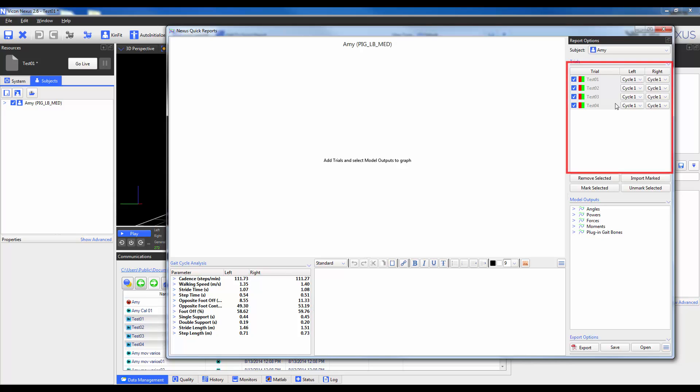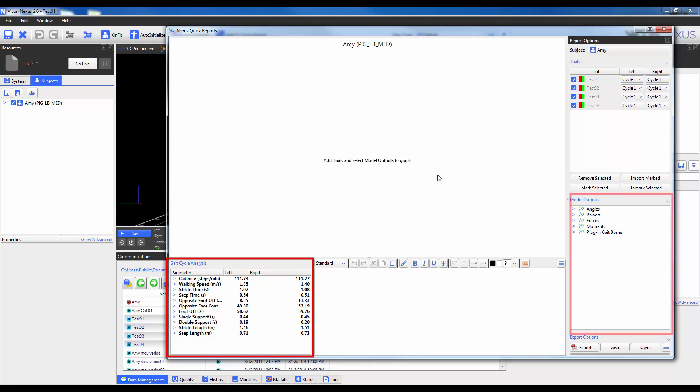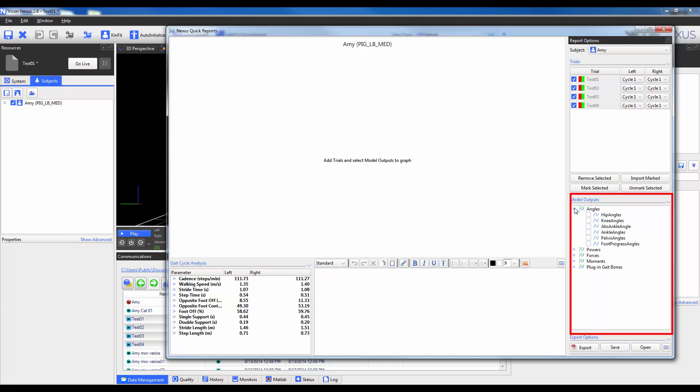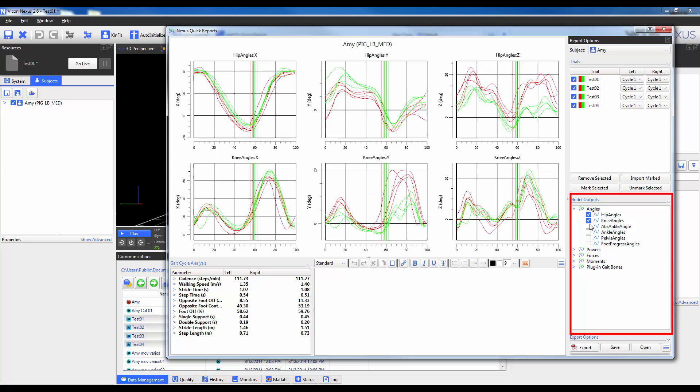With trials populated in the top right corner you can see that gait cycle parameters get automatically calculated in the bottom left corner. You will also notice that there are model outputs available for selection in the bottom right corner. These outputs can be displayed by expanding on the desired category and using the checkboxes to select the desired outputs. When selected all three components of that model output will be shown. If you display more than three outputs you will see arrows which will allow you to toggle between pages.